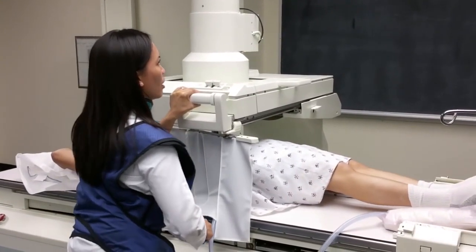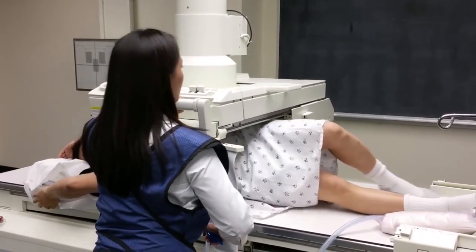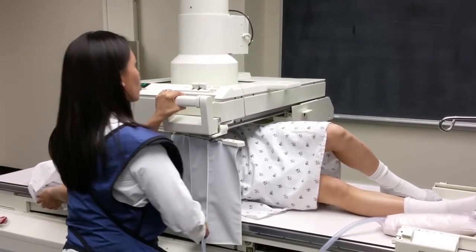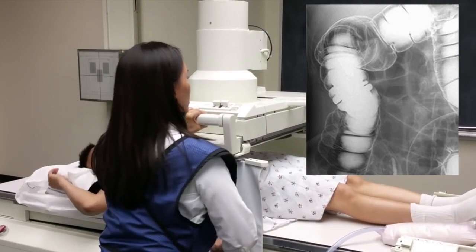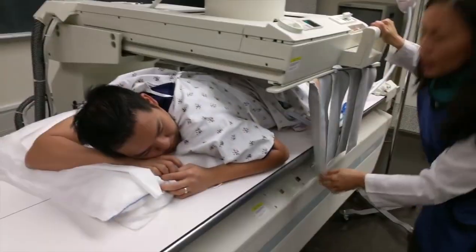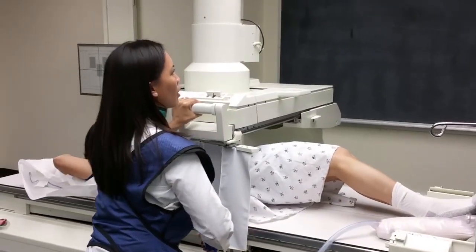With the patient in a supine position, I'll ask them to turn on their right side facing me to move the barium into the proximal hepatic flexure, then lie on their back so the barium flows into the ascending colon. The patient may be asked to again face down in a prone position, then turn back to a supine position to achieve adequate coating. Remember, barium is much heavier than air and will fill any dependent space.